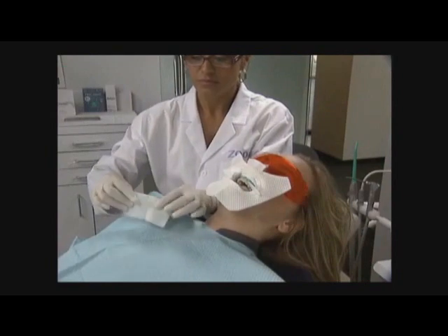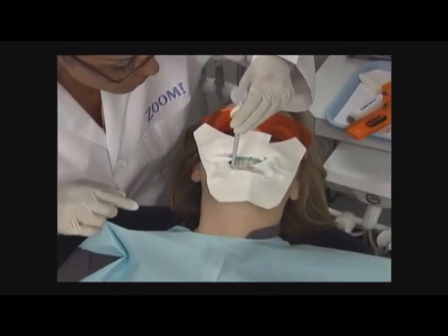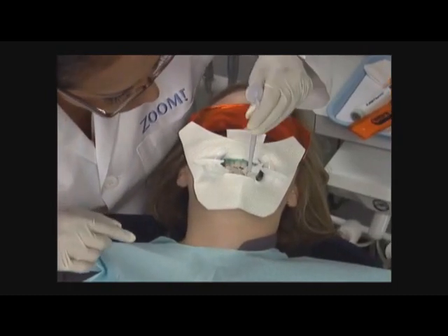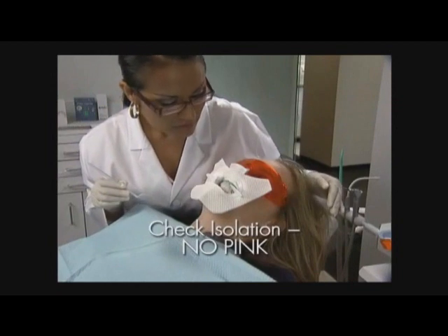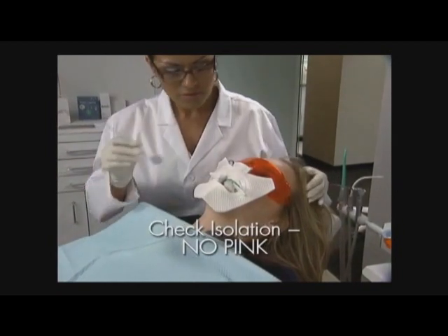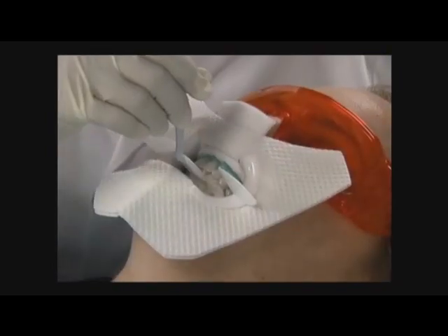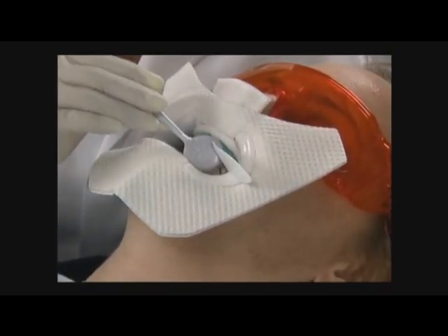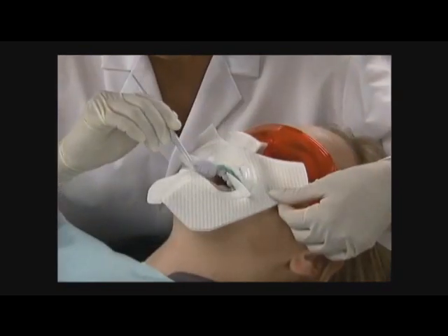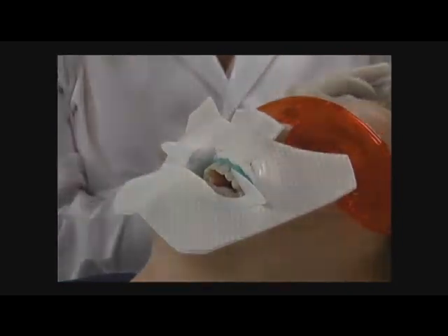Open the final piece of gauze and place it between the teeth, over the retractor's tongue cup. Make a final check to ensure no tissue is left uncovered. Use the motto, "No pink," as a standard. Check the interproximal areas of the application, especially on your blind side. Check the entire oral cavity to ensure all tissue is covered. Apply additional gauze or Liquidam where necessary.